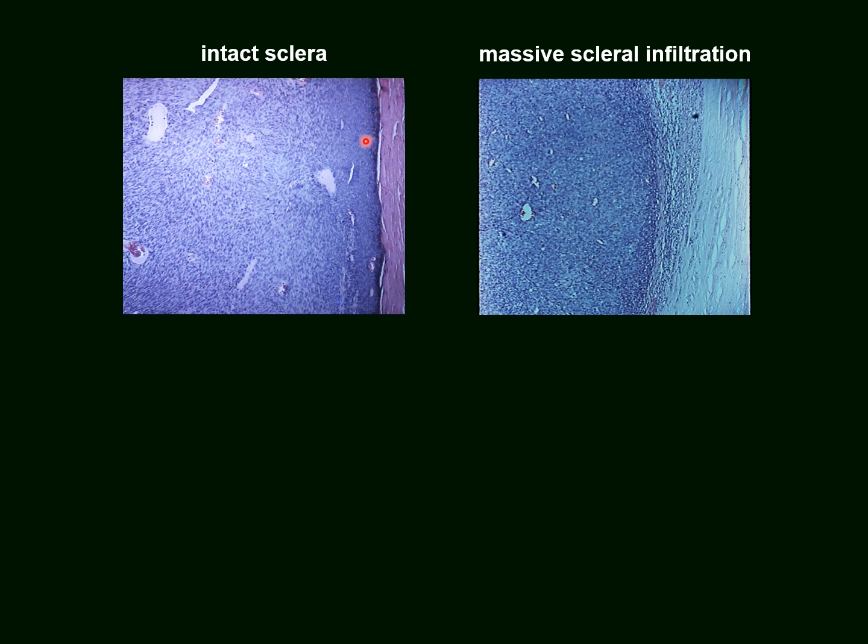There's a condensation of the choroid that was infiltrated by the tumor, and this is a surface that sometimes produces an extra medium-high signal in front of the scleral signal. But the sclera here is intact. By contrast, on the right side we see massive scleral infiltration. The sclera is also thinned.